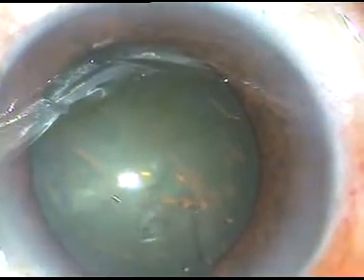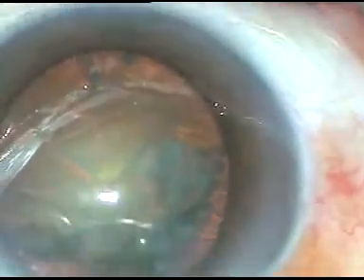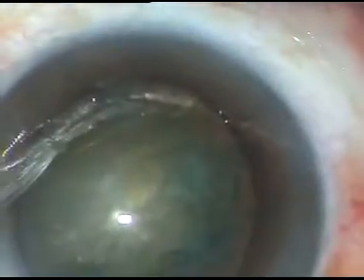Hydrodissection is done. The fluid wave is passed just underneath the anterior capsular rim, and I see that the fluid goes to the other side. Then I depress and the fluid comes anteriorly along the equator. Rotate the nucleus, and that's it.